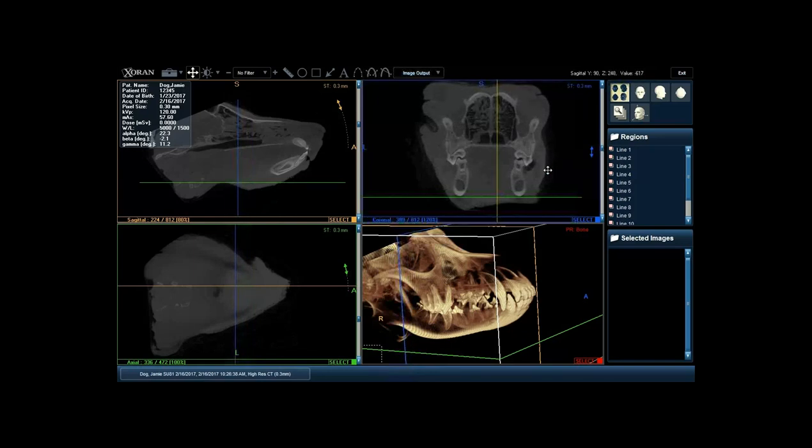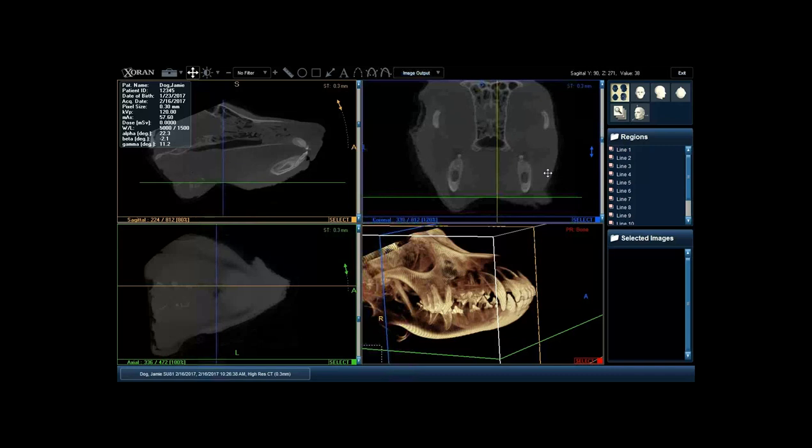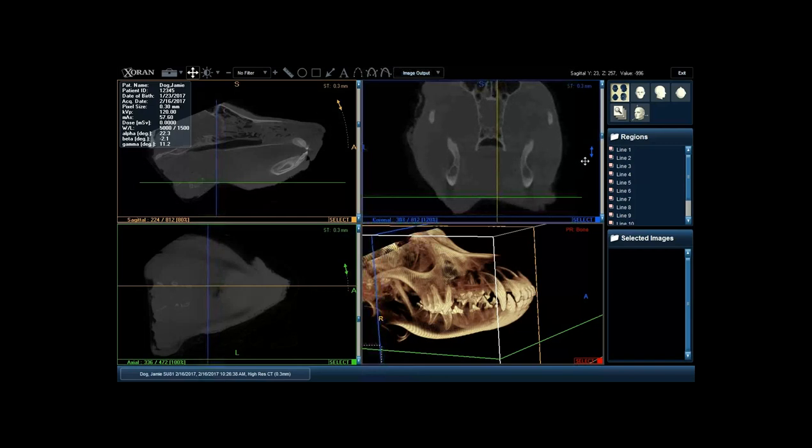We can see the occlusion, the position of those roots, and identify the nasal cavity as we go through. Continuing to scroll back, scanning all the way to the back of the head. You can start to see just how close some of those maxillary roots are to the thin layer of bone. You can identify that on this plane - there's a little bit of root visible here and here - and we continue to go back and identify what's happening.